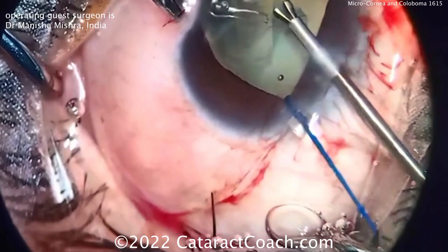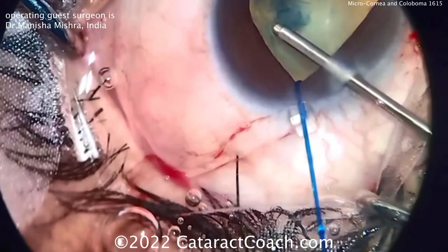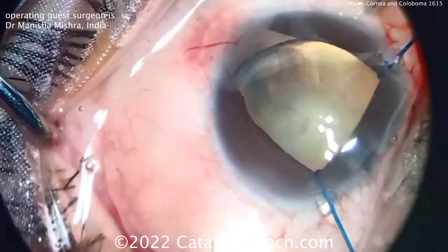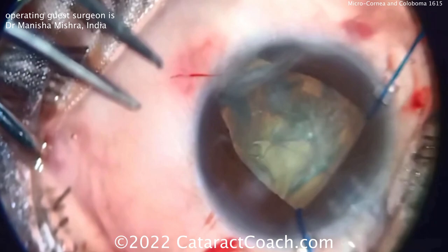The video is not well centered and the resolution isn't great, but it's still a neat case with a lot to learn. Using these forceps to create our rhexis — keep in mind this patient may have a very small crystalline lens as well. Making an incision here, let's take a look at what's going to happen next.